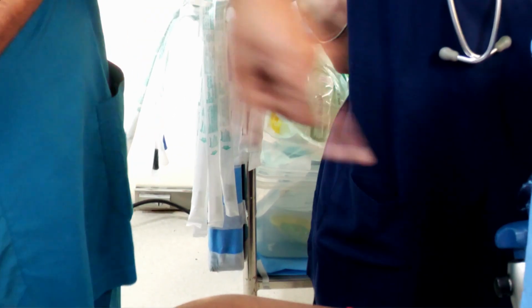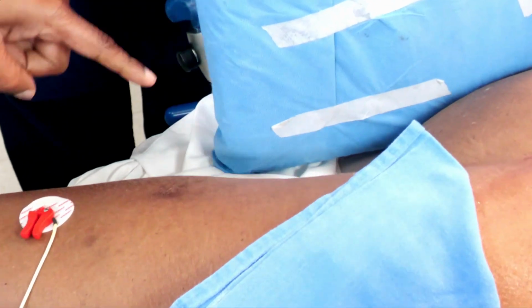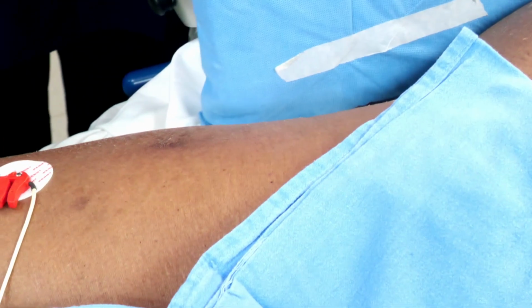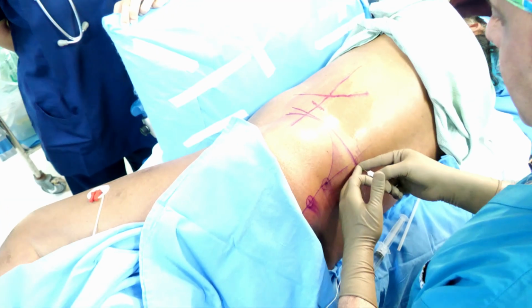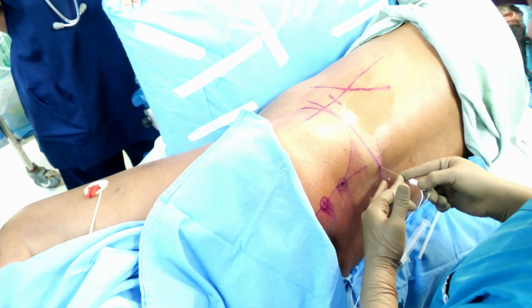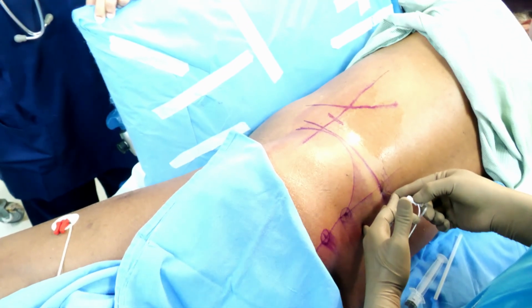So can you see contractions of the abdominal muscles? If somebody can point out the contractions of the abdominal muscles, it means that the needle is going in the anterior thoracolumbar fascia. It's stimulating the ilioinguinal and iliohypogastric nerves. You can very well do an anterior quadratus lumborum block with some amount of local anesthetic technique. It means that my needle has to go a bit more medial, sorry. So slightly repositioning that and going a bit more medial.